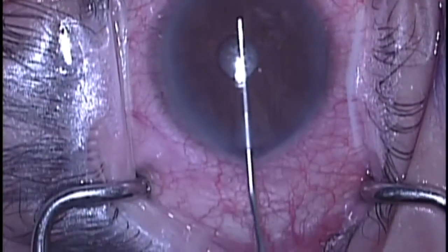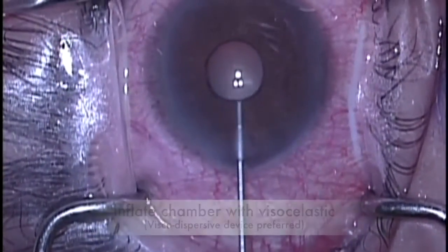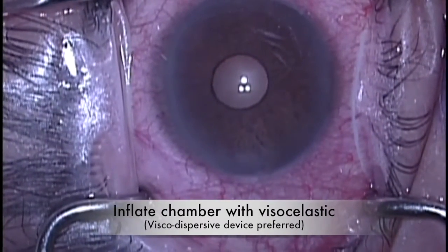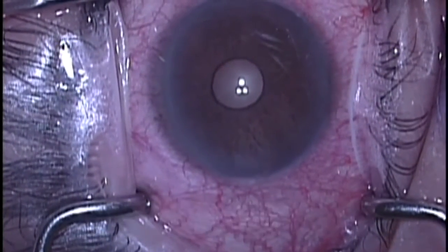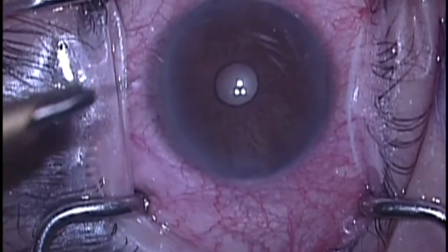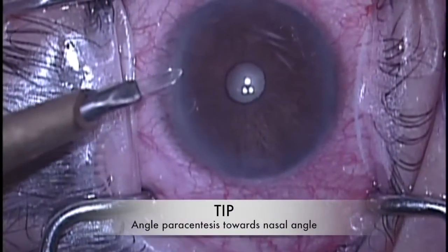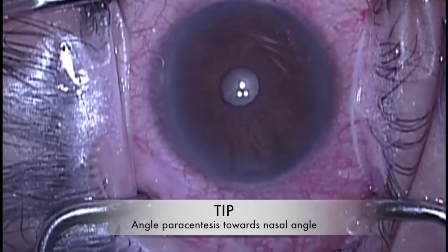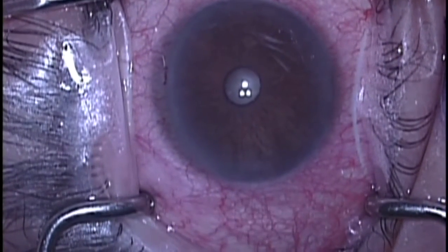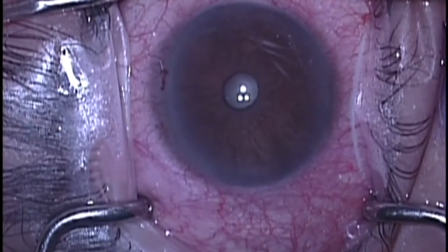Viscoelastic is then infused into the anterior chamber for anterior chamber maintenance. I prefer using a viscodispersive OVD as it lends itself to better maintenance of the anterior chamber depth and pressure during intracameral manipulation. During the paracentesis, angle the paracentesis towards the nasal drainage angle.